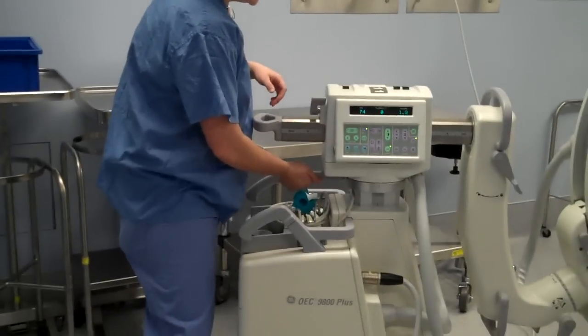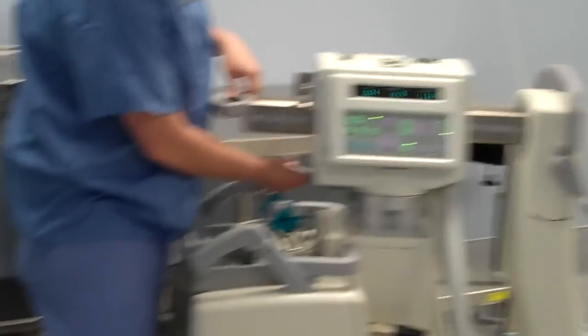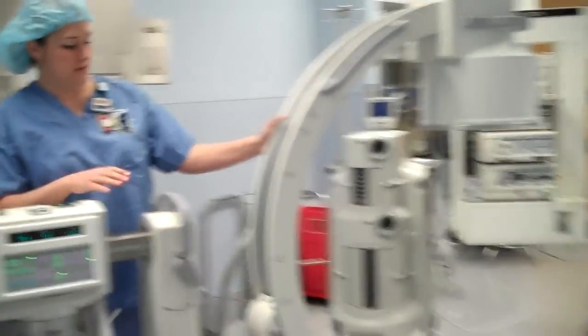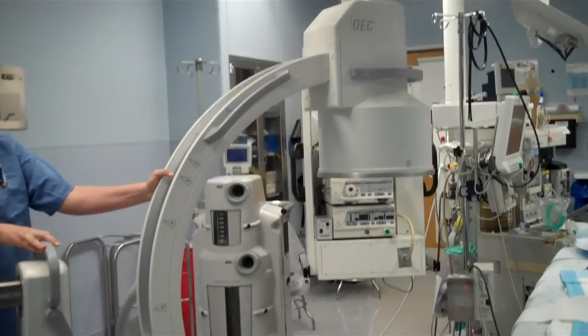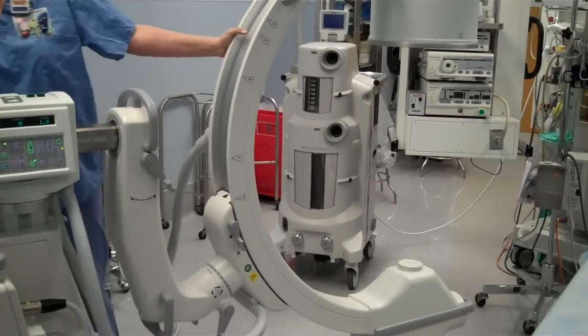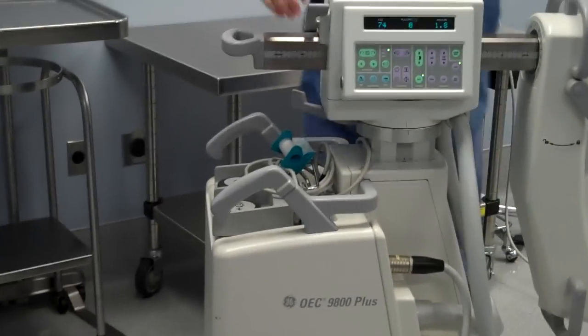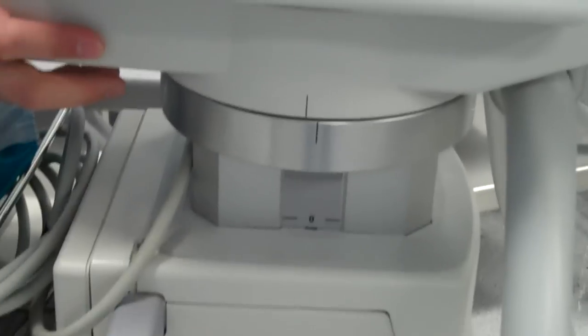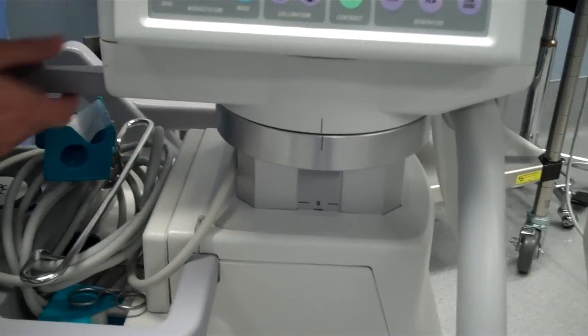This lock right here is the side-to-side lock. This is the release for that. This allows for the C-arm to swing this way and also this way, again without moving the base. To check to see if this lock is zeroed out, there's a little hash mark right here — these two lines need to line up so that you know you're zeroed out on that one.